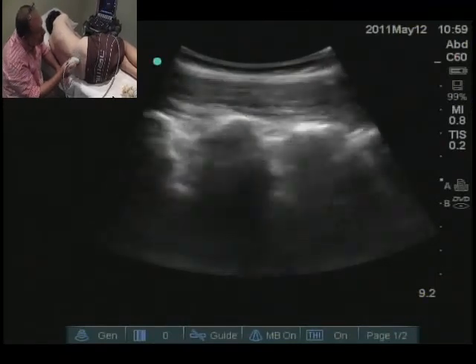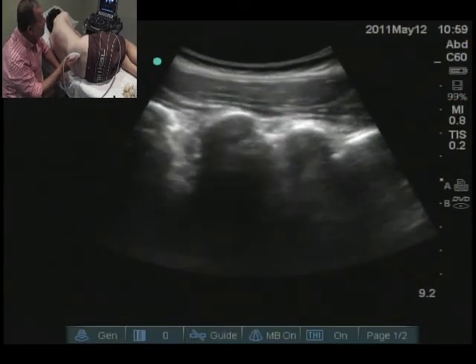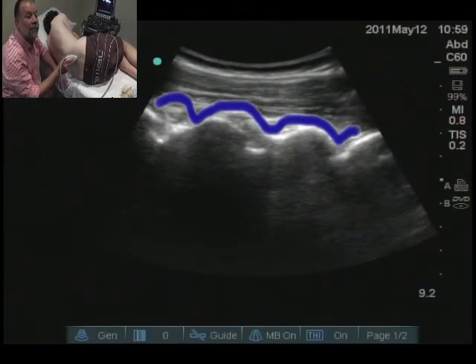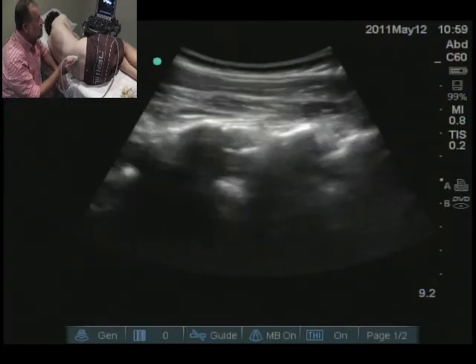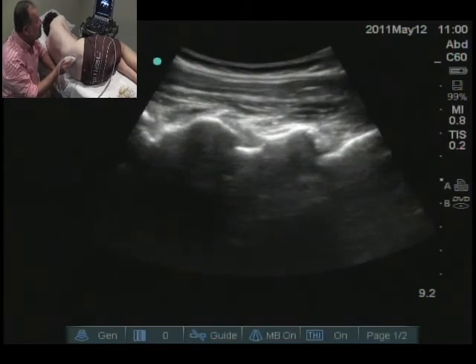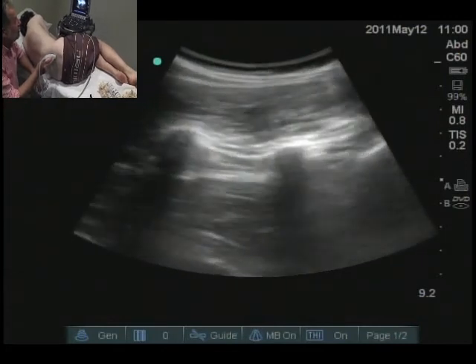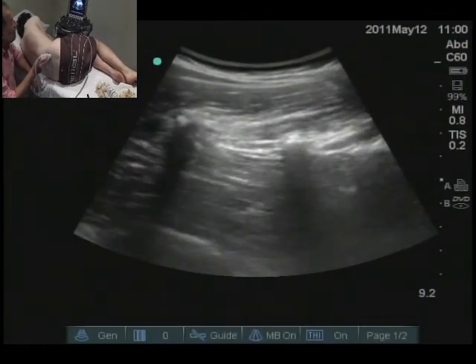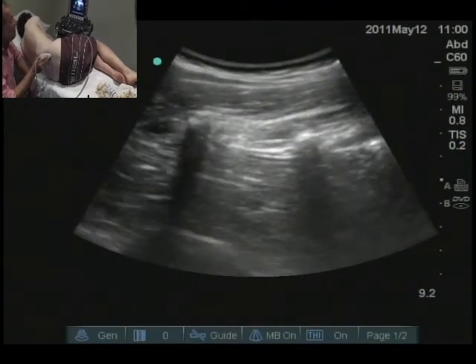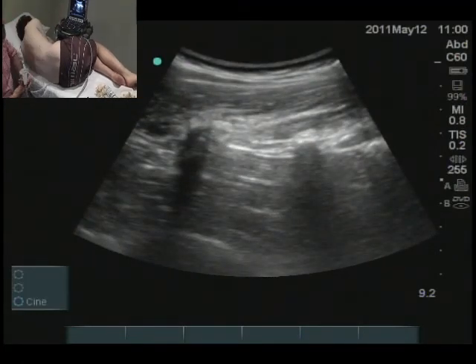Equally, if we now turn longitudinally, and you've all been shown the sawtooth picture, yes? So the sawtooth picture, what's that formed by then? It's the articular processes. If we angle in, then you get your epidural, you're going into the interlaminar. What we don't want to do is angle in now. What we want to do is move laterally. So when we move laterally, what do we see now? The two transverse processes. So if we freeze that, this fine white line is your dura, and between the two is your epidural space.